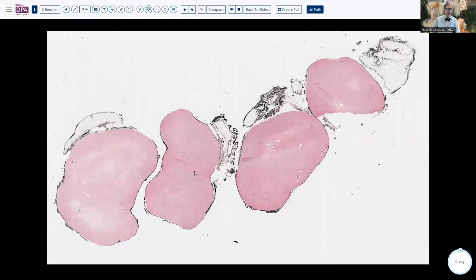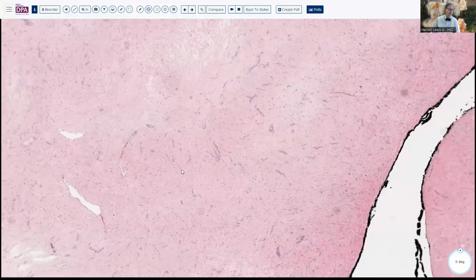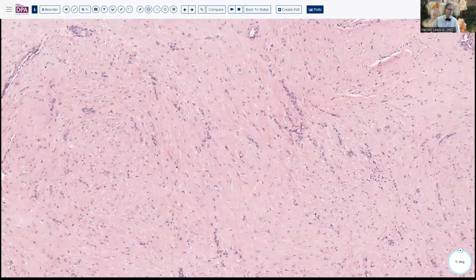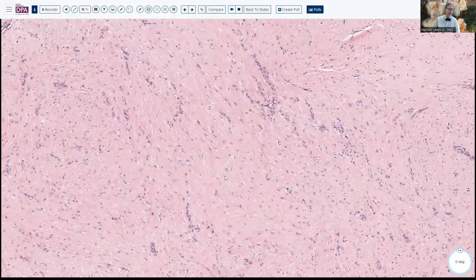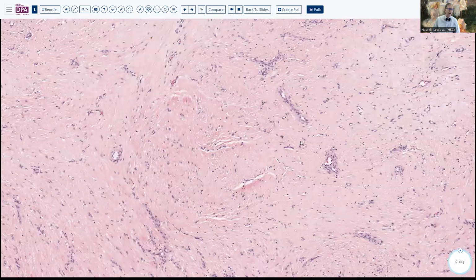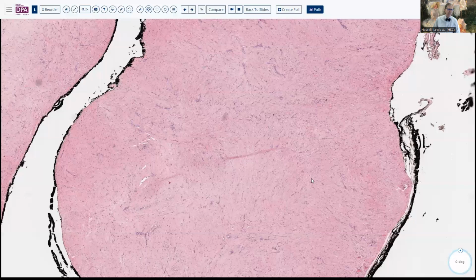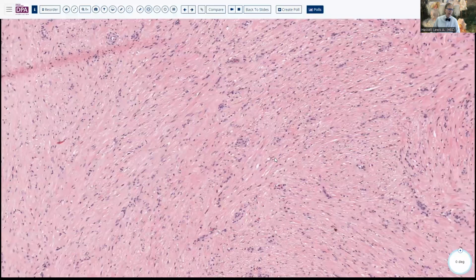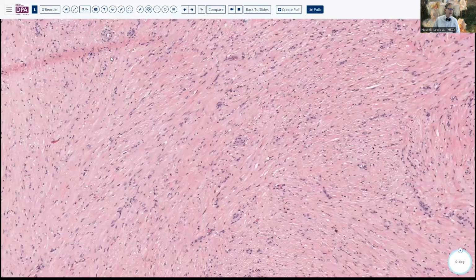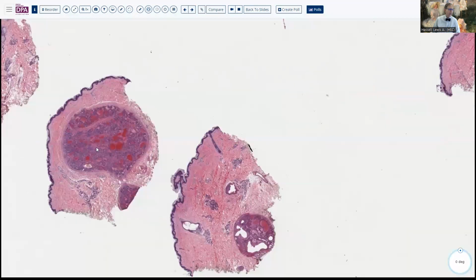And lastly, here an angioleiomyoma, which shows a degree of smooth muscle differentiation. Doesn't look particularly like the glomus tumor. And so not really a true histologic differentiator, but clinically this type of a lesion certainly could cause pain as well, and may on occasion have a very prominent vascular component to it. So in comparison, here's a couple of other glomus tumors.